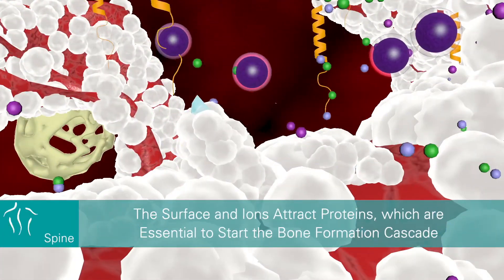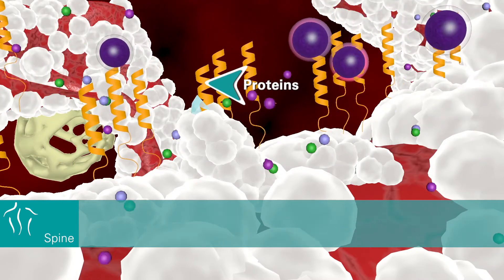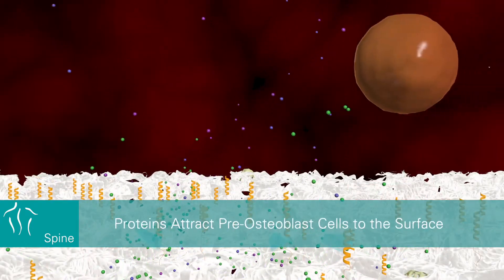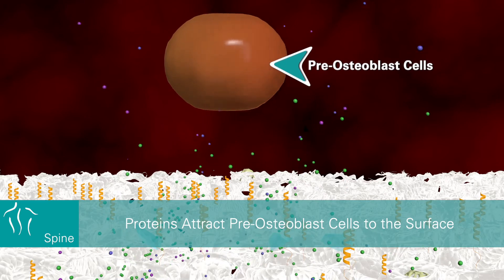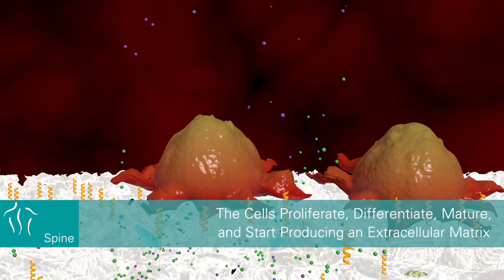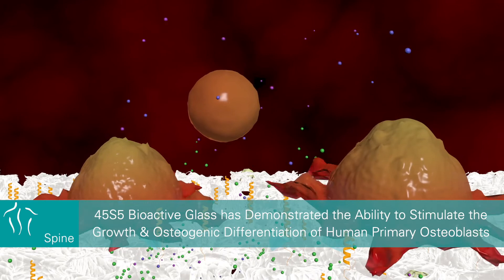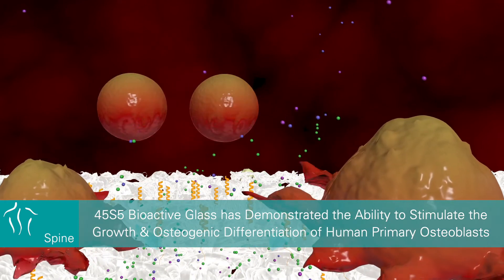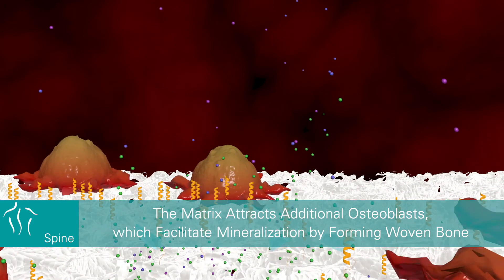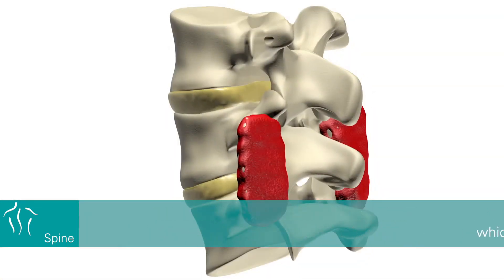The surface and ions attract proteins which are essential to start the bone formation cascade. The surface properties ensure that the proteins attach to the surface with the correct conformation. The attached proteins attract pre-osteoblast cells to the surface; the cells proliferate, differentiate, mature, and start producing an extracellular matrix. 45S5 bioactive glass has demonstrated the ability to stimulate the growth and osteogenic differentiation of human primary osteoblasts.